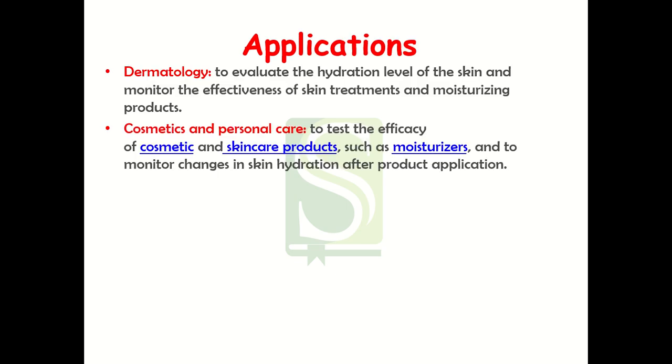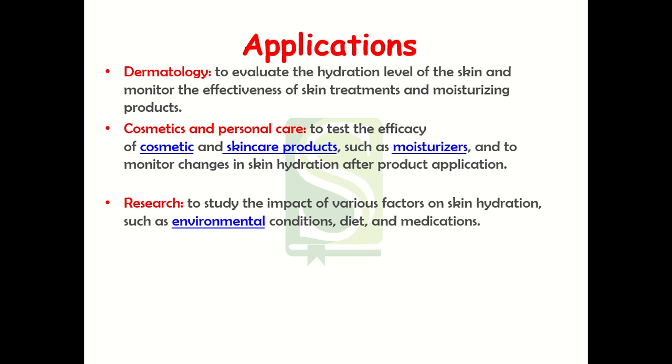Now, what are the applications? You can use it in the dermatology industry to evaluate the hydration level of the skin and monitor the effectiveness of skin treatments and moisturizing products. It is also used in cosmetics and personal care to test the efficacy of cosmetics and skincare products like moisturizers. Before application and after application, the change in the hydration level of the stratum corneum can be evaluated. If you can do this, you can test the efficiency of your moisturizer.